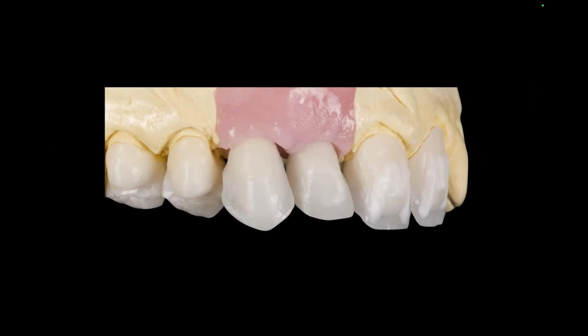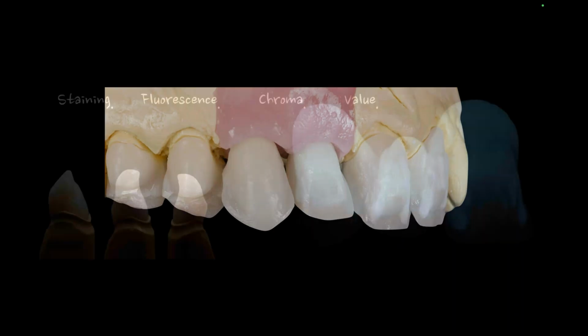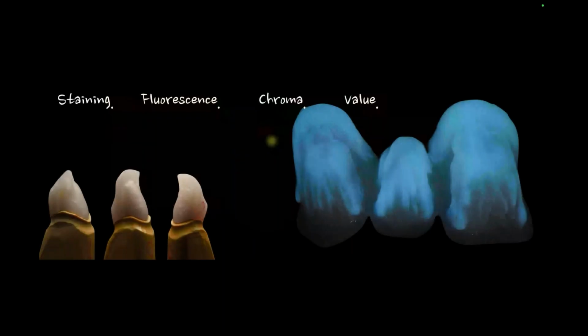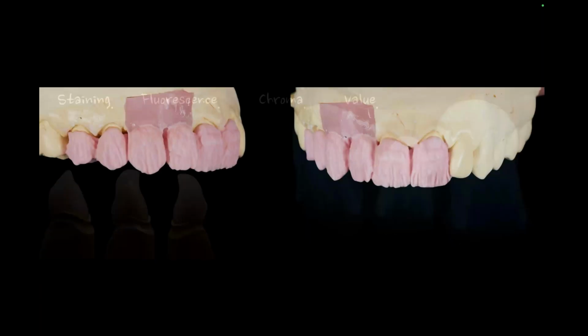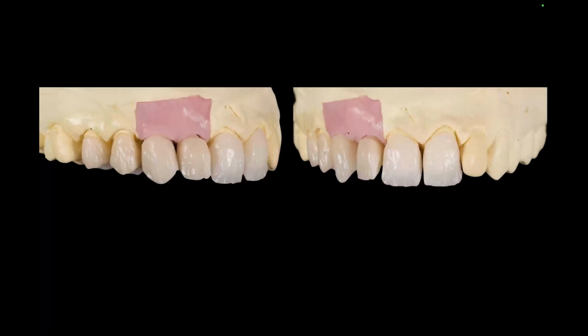And then I'm going to start putting my powders on to enhance some of those things. And this will be maybe a fluorescent powder, a little cervical fluorescent powder here, something to increase that light kickback, and then layer a little bit of dentin over it, where I get that fluorescence up and down those line angles, which is really helpful for me. Then I can just do kind of a normal dentin buildup. And I don't mind if my dentin is only 0.6 of a millimeter, because I have the support underneath to create the right density. Then I'll finish that with my enamels, work through the case.